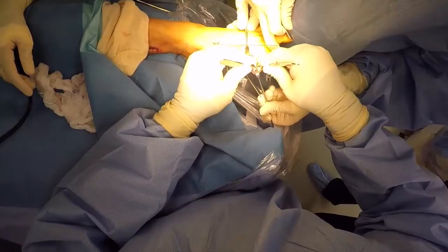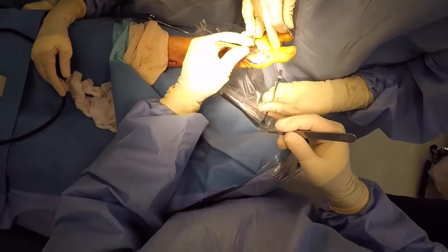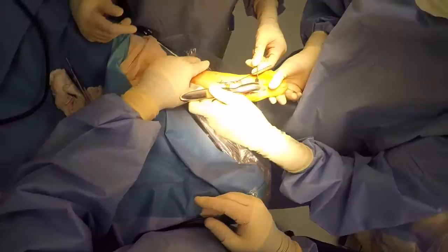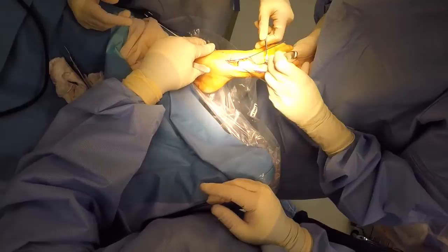While we're waiting for our C-arm, which is in use in an adjacent OR, we are actually making our distal first metatarsophalangeal joint dissection in this case. So we have the joint exposed, and here we are utilizing a McGlamour elevator to free the sesamoids and plantar ligamentous attachments for facilitation of correction of our bunion deformity.